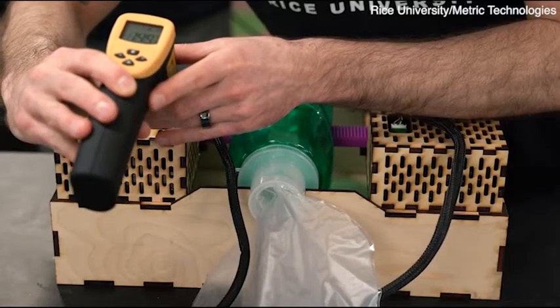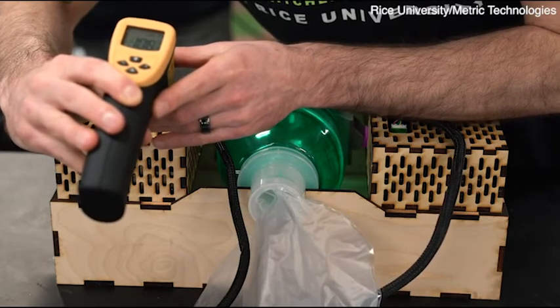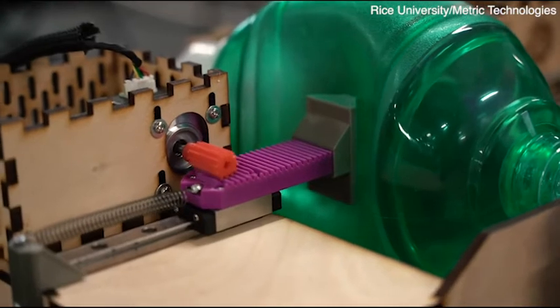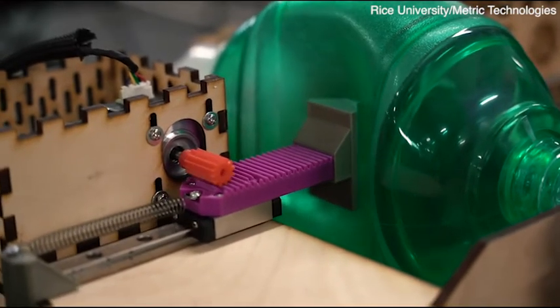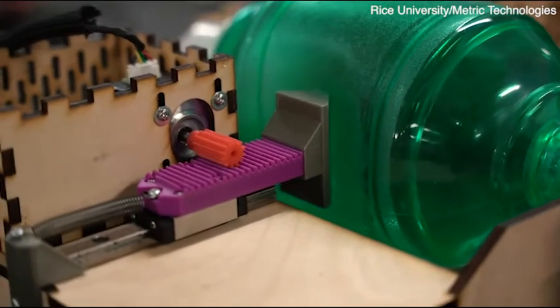This is not a high-tech device that requires a lung doctor or pulmonologist to set. This is a device that could reduce the load on existing ventilators to basically help people who are in respiratory distress, but not at a critical case. When you mechanize that motion, you put sensors along that mimic the respiratory cycle. That turns it into something very unique, and you get essentially all of the functionality of a full ventilator, especially with sensors and safeguards, which is what we've done at Rice.